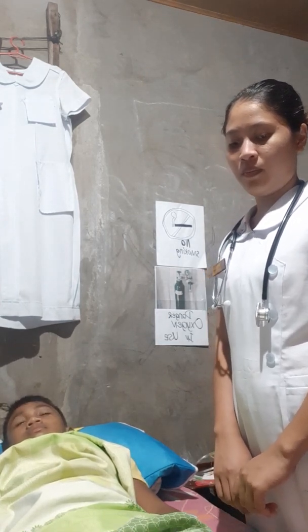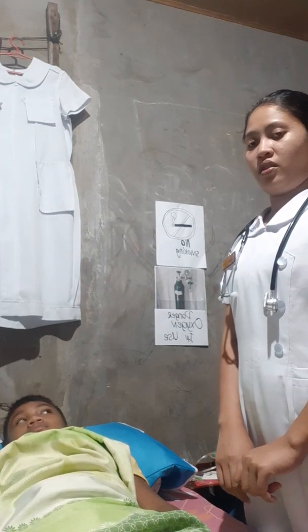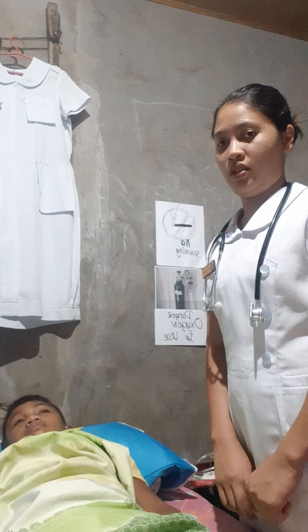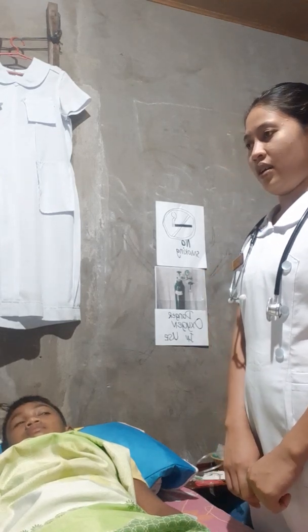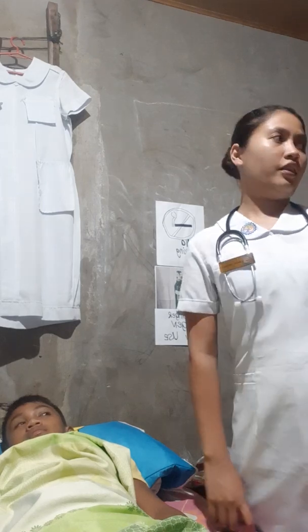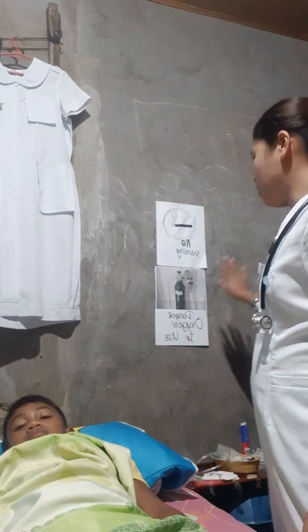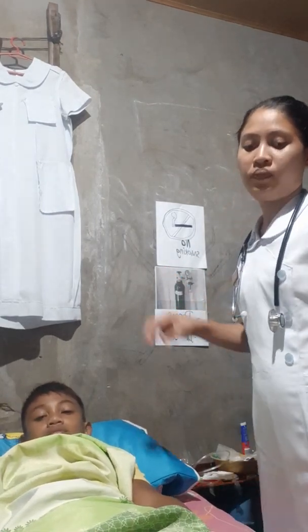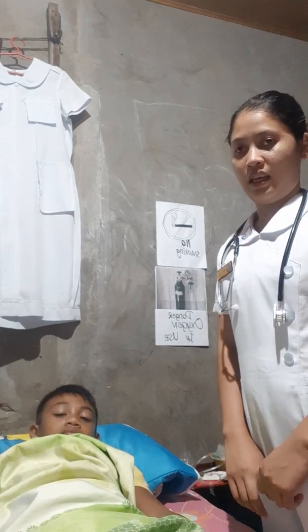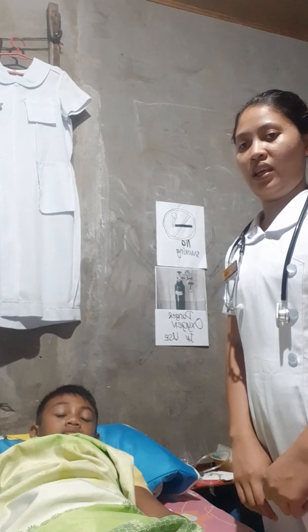So after that, review the safety precautions when oxygen is used. Place the sign no smoking and oxygen in use at the entrance of the room and at the head part of the bed of the client. Next, perform hand hygiene and put on PPE if indicated.